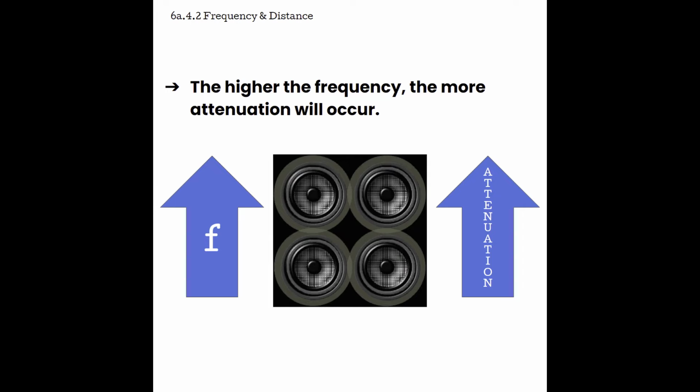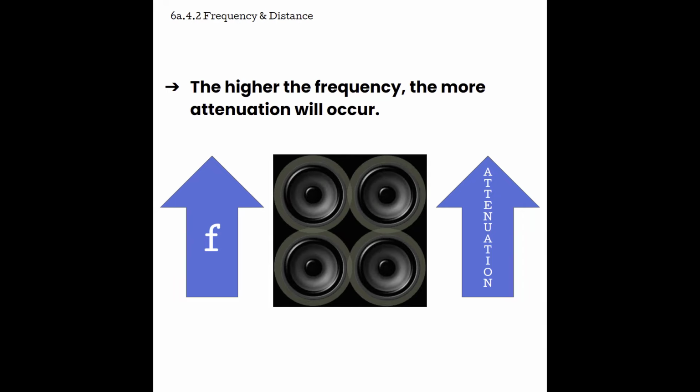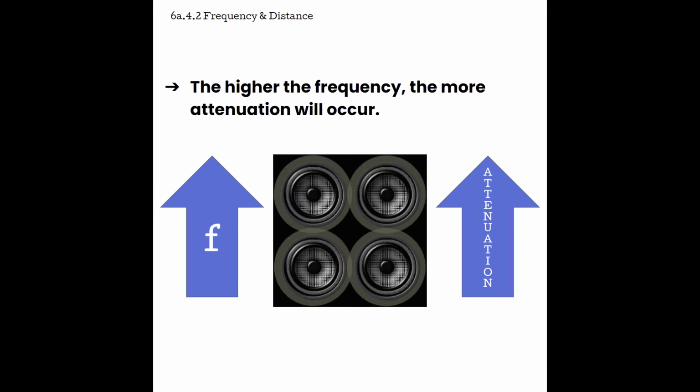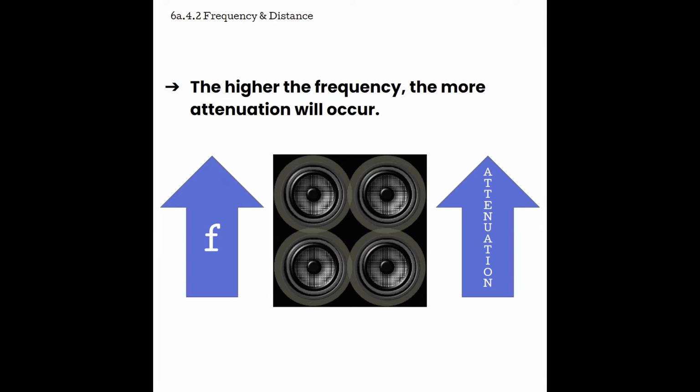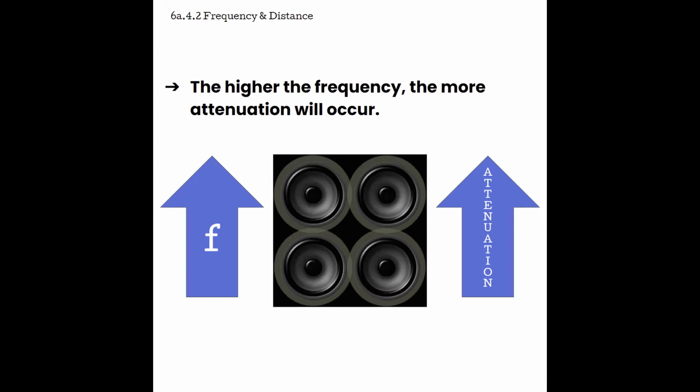And most of us have actually probably experienced this. If you've ever lived in an apartment building or a dorm or other close quarters, if a neighbor starts playing really loud music, what can you hear? Typically just the bass notes. And that's because those higher frequencies of a melody are going to attenuate more quickly compared to the low frequency of the bass notes that are going to continue transmitting going through the walls.